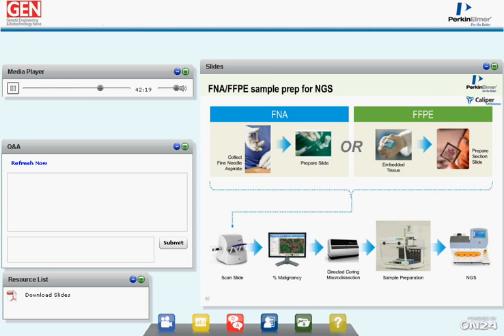So this slide captures how we're looking at the overall workflow. Samples come in as either FNAs, or fine needle aspirates, or core biopsies or resections. It's usually the latter. Next, the challenge is to remove from the block or the slide tumor-rich material. And then once that material has been selected, understanding what the percent malignancy of the material is, as Mike discussed earlier.